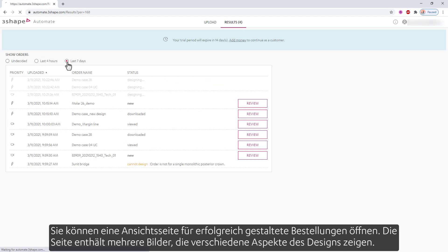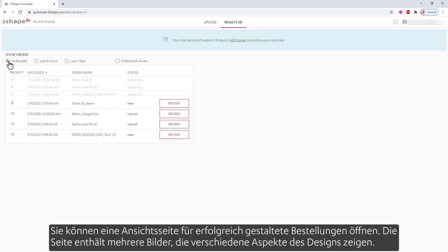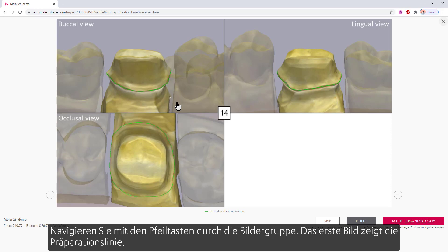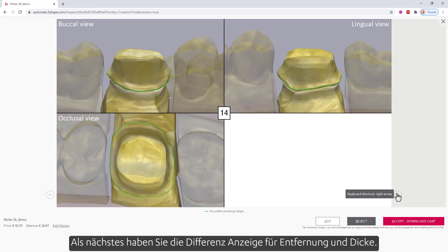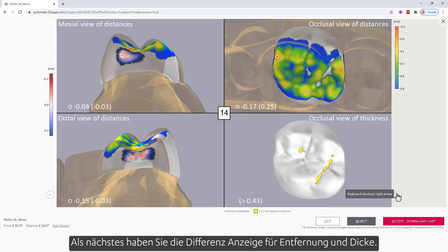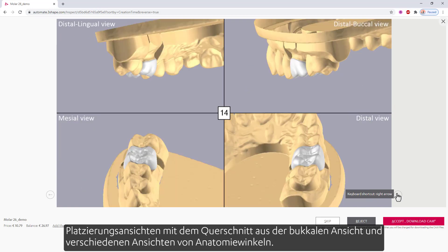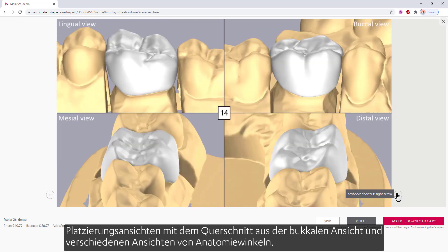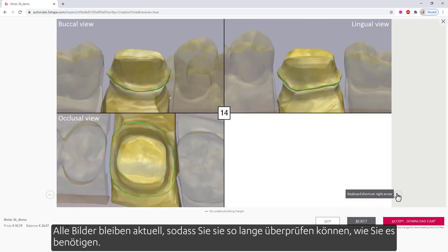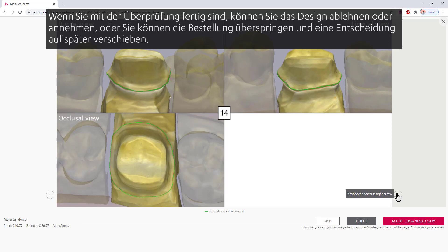You can also view all orders within some time intervals. You can open a view page for successfully designed orders. The page has several images showing aspects of the design. Navigate through the set of images with the arrow keys. The first image shows the margin line. Next, you have distance and thickness heat maps, placement views with the cross section from the buccal view, and different views of anatomy angles. All the images will stay in the loop, so you can review for as long as you need. When done reviewing, you can reject or accept the design, or you can skip the order, postponing a decision until later.